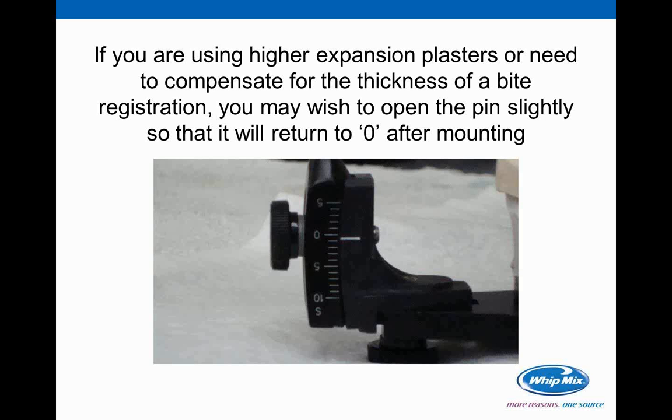Okay. Now, if you're using higher expansion plasters, or if you need to compensate for the thickness of bite registration materials, some bite registrations are a little heavier than other bite registrations depending upon the practitioner, you may wish to open the pin slightly so that it will return back to the 0 point after you finish mounting. You'll be able to tell that on your particular articulator and the use of the individual registrations that are sent to you.